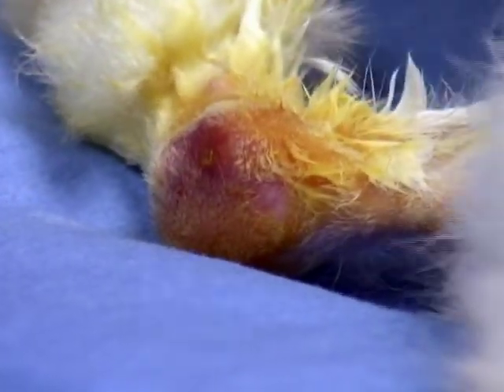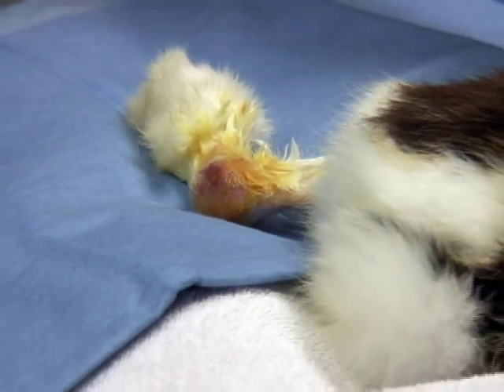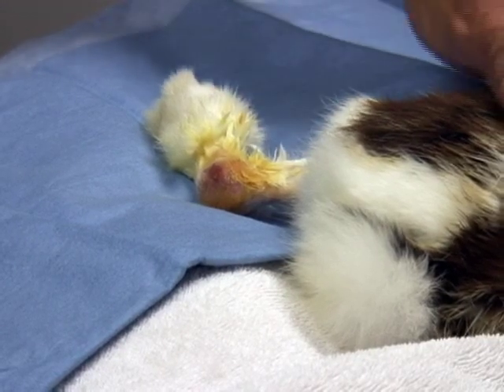We've got our sample. We're going to allow this rabbit to wake up. We're giving him pure oxygen now, and we'll give him oxygen until he starts to recover.